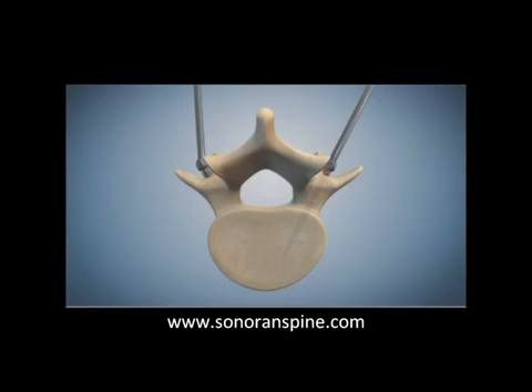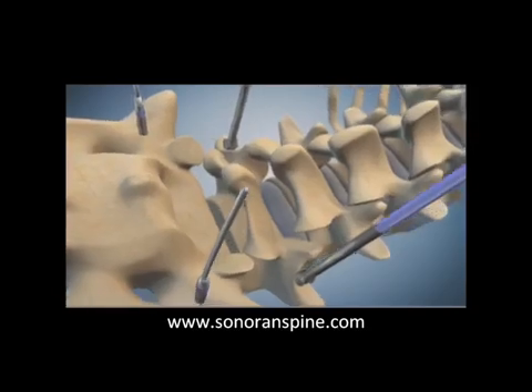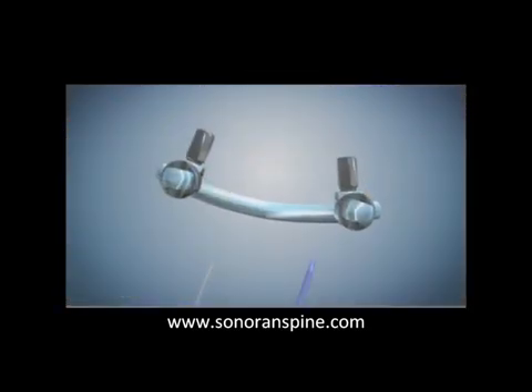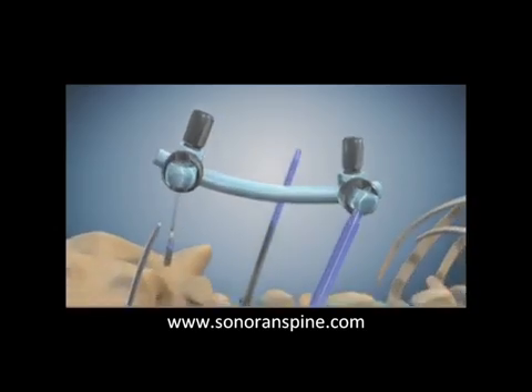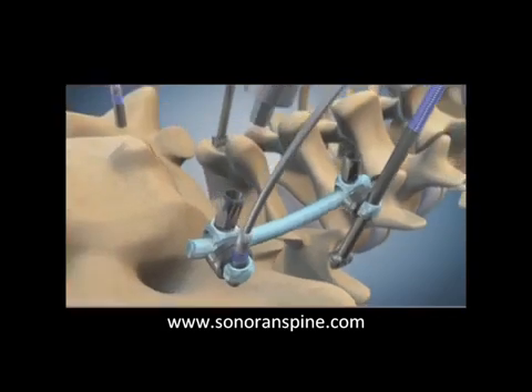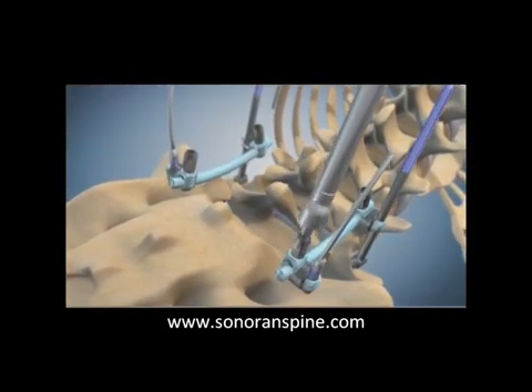That gives better grip on the screw so the screw won't loosen. Notice how the pivoting hinge on those reduction screws is oriented in the side-to-side direction. The contoured rod with connectors is then dropped into place using the nitinol screw extender that's placed in the tip of the S1 screw.